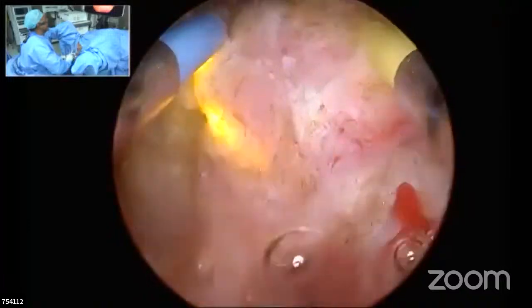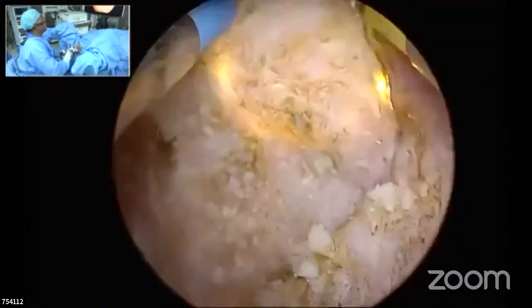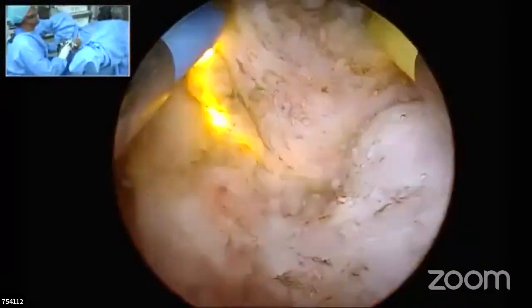Now having almost done the debulking of the main part of the prostate on one side, that is on the left side of the lobe, I'll not go right up to the capsule now. I'll keep it for the end, and now I'll look at the bladder, this apical area on that side.